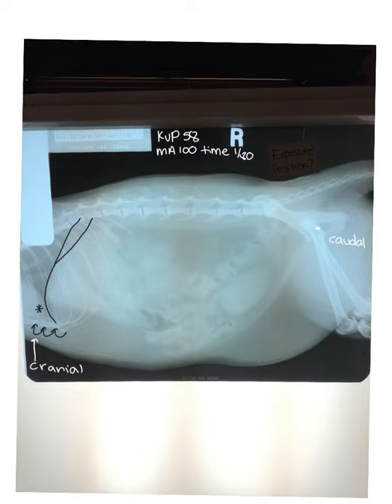So for this x-ray, if we start off by looking at the positioning on it, you can see I've drawn in the cranial landmarks there. The black lines are outlining where the diaphragm is. I have a star on the apex of the heart. Then the little arrows there are taking you up the 2 to 3 intercostal spaces cranial to the xiphoid process. And that is where our cranial landmark would be. So that is in our field of view.